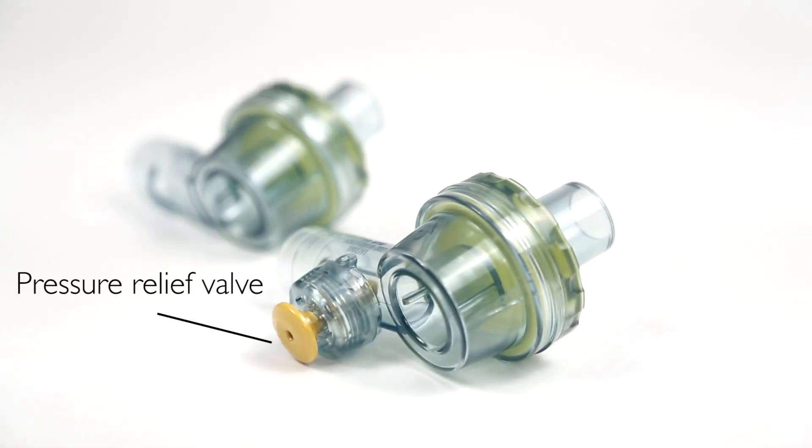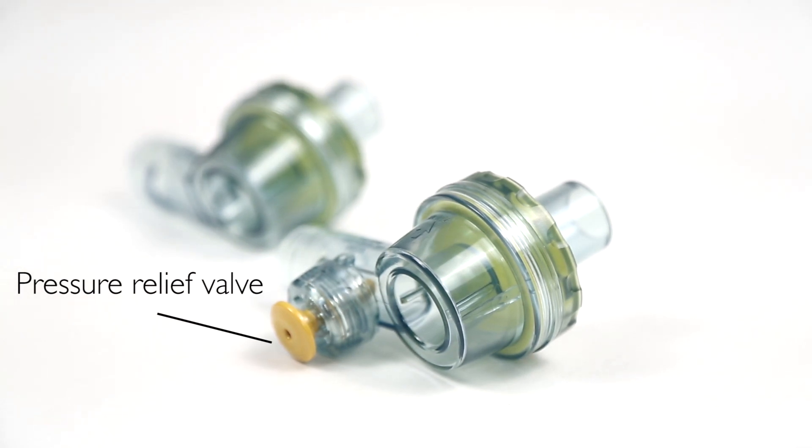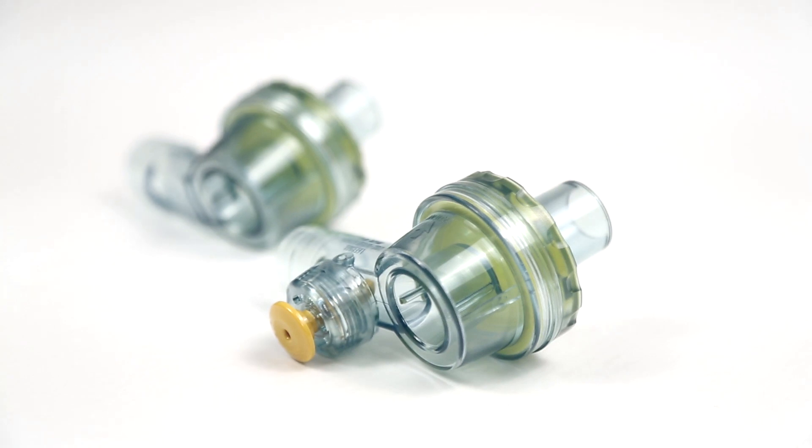A pressure relief valve is standard on the pediatric and preterm configurations. This prevents airway pressure from exceeding 35 centimeters H2O. When higher airway pressures are necessary, the valve can be closed by pushing down the valve stem or using a lock clip.